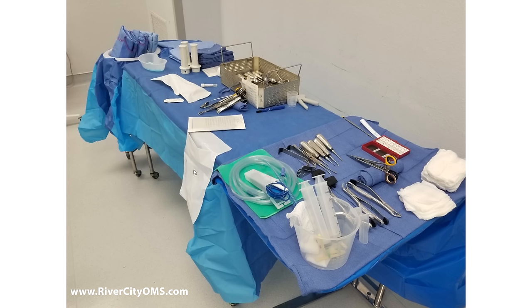Got a little trash bag there where it's sterile. We can put our sterile trash in there, and then if we decide we need it again, we can retrieve it without contaminating ourselves. That's a staple gun there. These are just little cups to hold liquids. That's a marking pen for the patient.